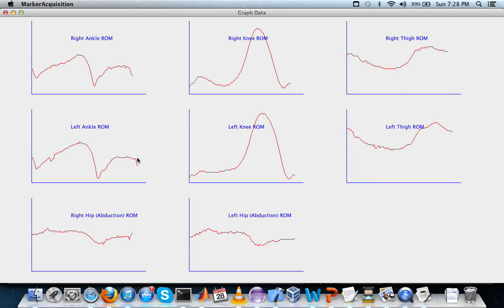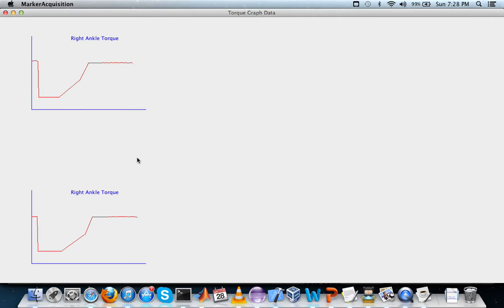scaling factor. Then the next graphs that generate are the torque graphs, and there are going to be 6 on this page. These are right now generated very roughly. Essentially, all you're really seeing here is a small bump. This is where, immediately after the heel has struck the ground and the foot is falling, there's a small positive torque to make sure the foot doesn't fall too quickly. And then there's a large depression here, which is the main torque generated downwards. That's to lift your heel off the ground when your weight is bearing down on that leg.